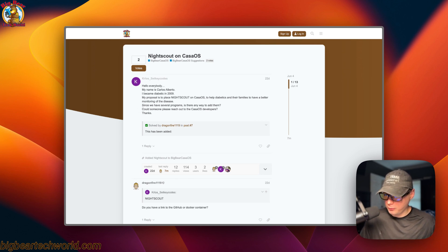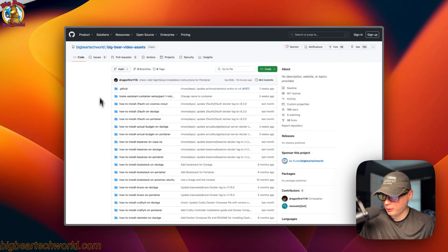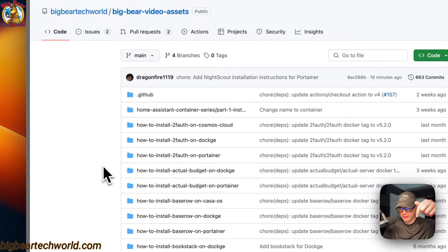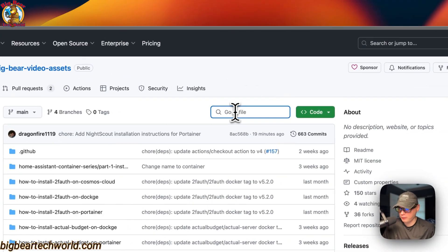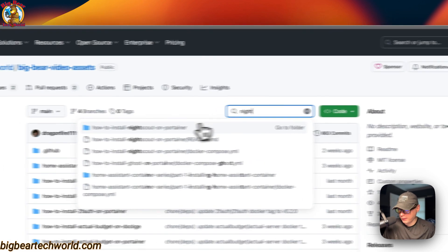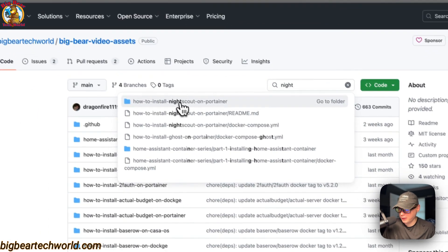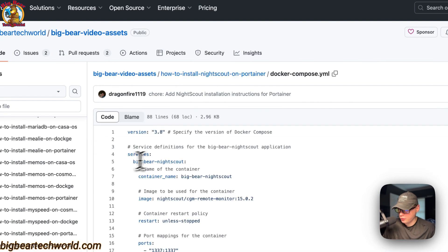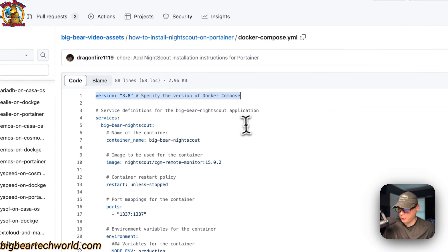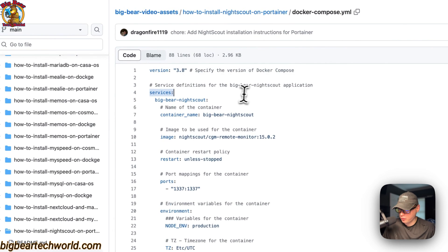Now I'm going to start on Big Bear Video Assets — there will be a link in the YouTube description. I'll go to search and type 'night' and you can see 'How to install Nightscout on Portainer' right there. We're using Docker Compose with version 3.8 file format.